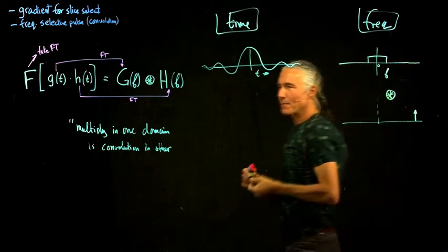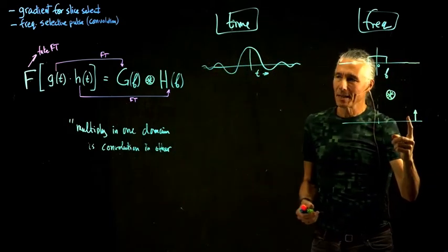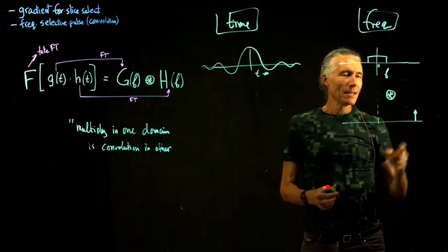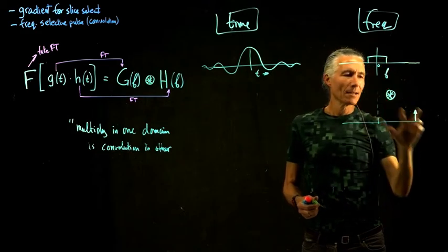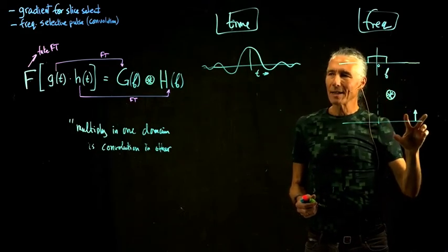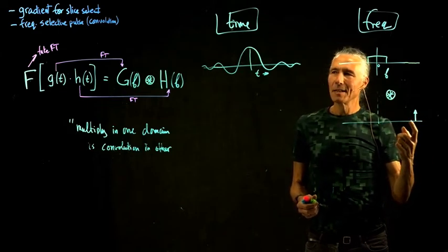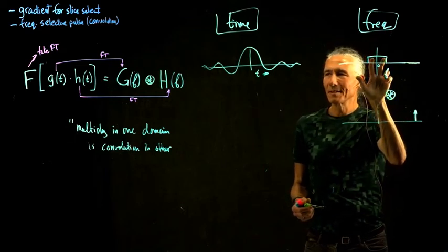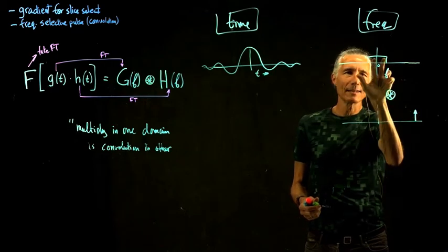When you convolve something with a single spike, that's kind of a special case. It will basically just make a copy of this thing around the spike. Why is that? Well, if you think of this thing as the filter, when you convolve it with this spike, it's going to blur this spike into something that looks like that.